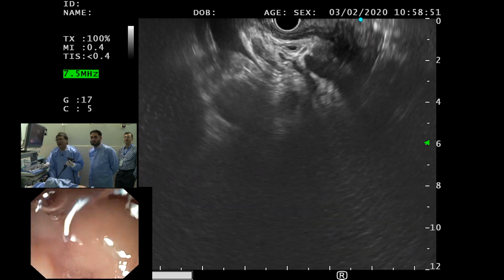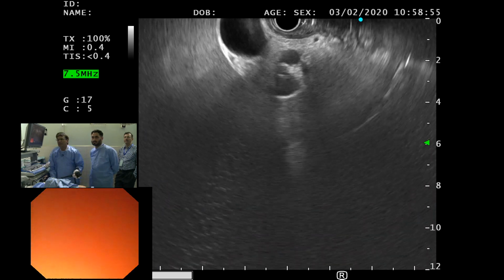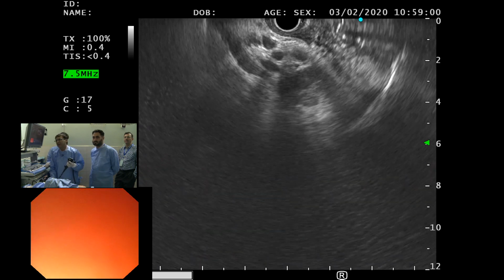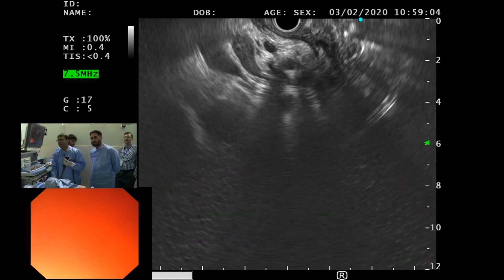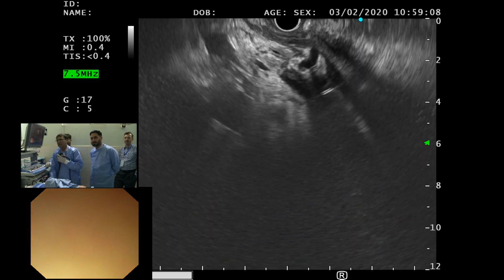And can you see the bile duct right there? I can't point to it, but that's a gallbladder up there and the bile duct right there. Anybody there to point to it? Hello. No, Dr. Saad is not here, Dr. Khalid.